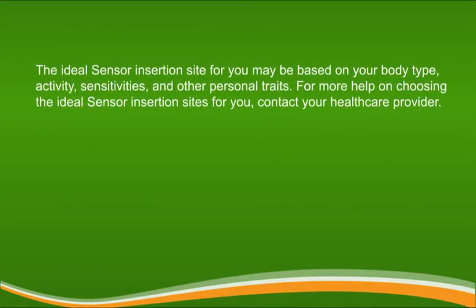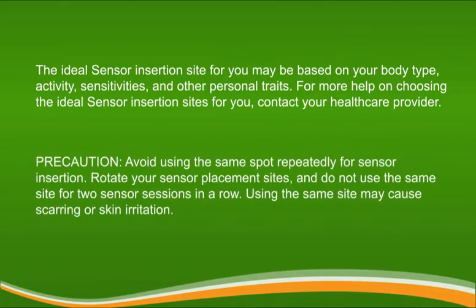The ideal sensor insertion site for you may be based on your body type, activity, sensitivities, and other personal traits. For more help on choosing the ideal sensor insertion sites for you, contact your healthcare provider.